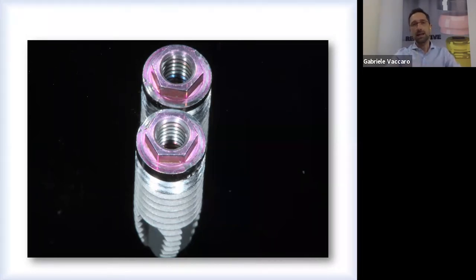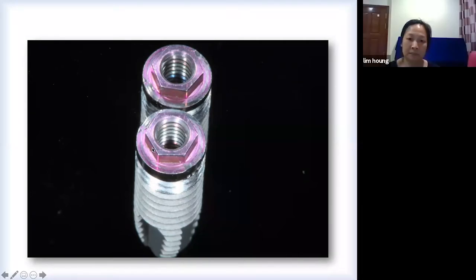Afterward, it was an improper use to use this for the single tooth. When we as dentists started to place single teeth over implants, we needed some reference point for the rotation of the crown over the implant. We kept this external hexagon as a reference point for the technician to keep the impression of the single tooth, but it was not designed for this purpose. The purpose of this implant was just to put a bar over four or six implants, connected with the plate around the hexagon, not connecting with the hexagon.